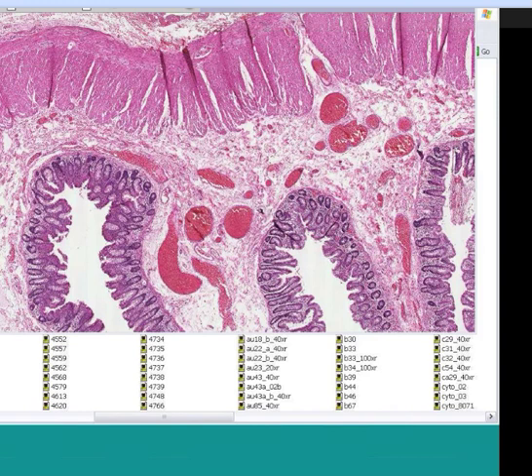If you did, we'll move on. And by the way, a lot of the pictures that I take and show you in class are actually taken from these slides. I do not rely on ripping off or Googling a slide from, you know, the University of Utah medical collection. I make my own because they're much better when you take them off of the slide. Okay, let's do another case.